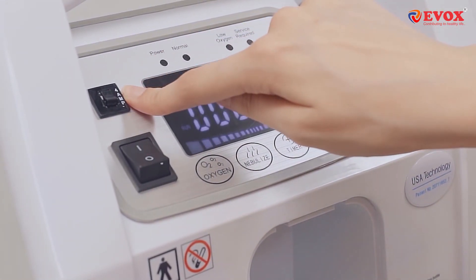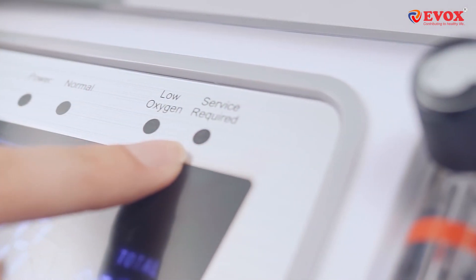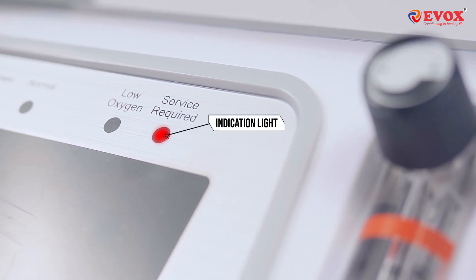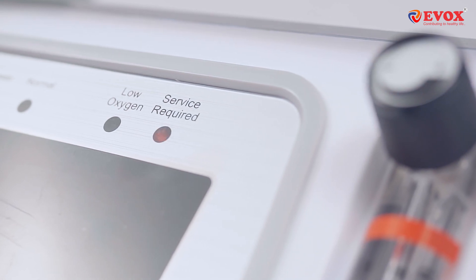This is the TRIP or MCB switch for safety during power fluctuations. If you experience a power failure at the location of use, a red light will blink on the service required indicator. Please don't panic — it's simply an indication of the power cut.